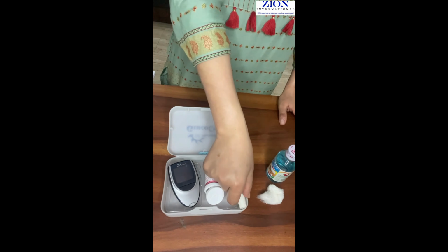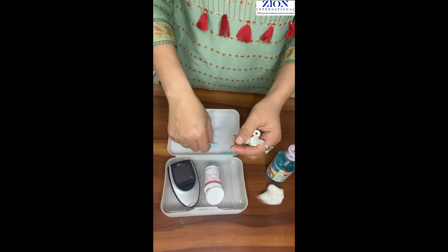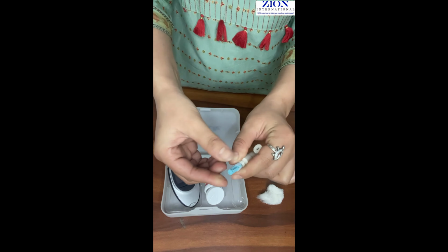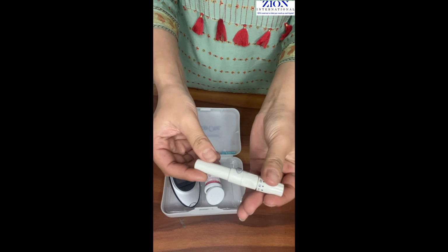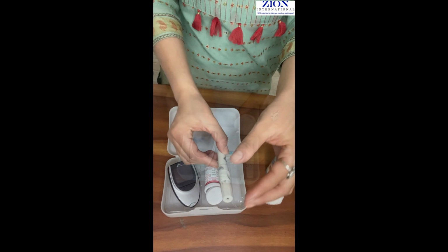First of all, let us prepare the Lancet pen. Open, take one needle, give a slight pull and insert it into the Lancet holder. Twist off the cap. Pull back the cocking control and then release. Now the Lancet pen is ready.